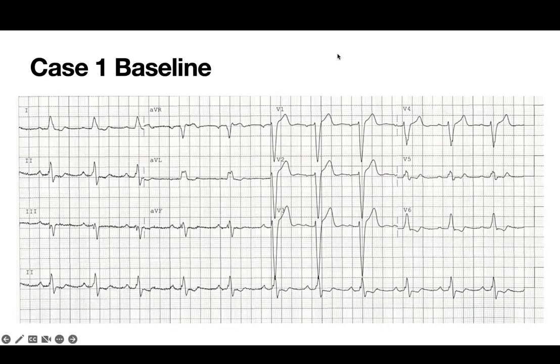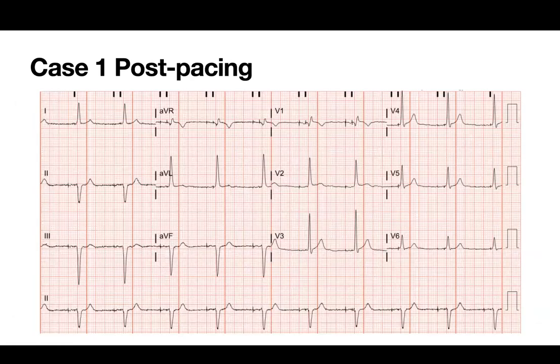And often you get a fusion on top of it and you get a very narrow QRS. For example, if we go to the next slide of this case, this is one of the first ones I started. I had done it with the Biotronik lead, and you get the fusion between the left bundle. This is more like the fascicle, the lower part of the septum that was being paced, low basal part, and you get a fairly narrow QRS. So if you have an ECG at baseline with the Strauss criteria looking nice like that, you can expect an ECG like this at the end.